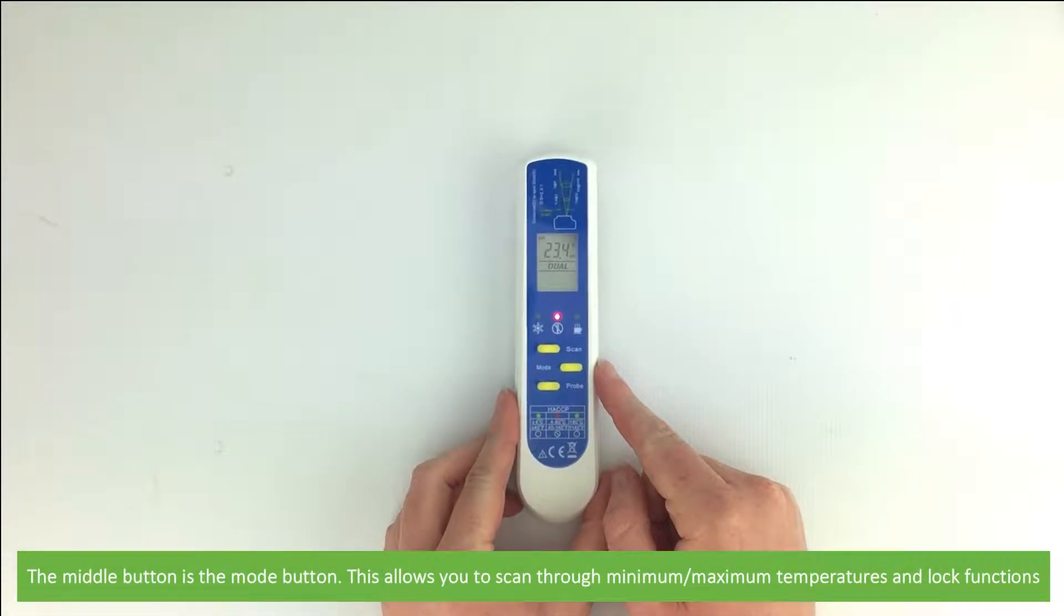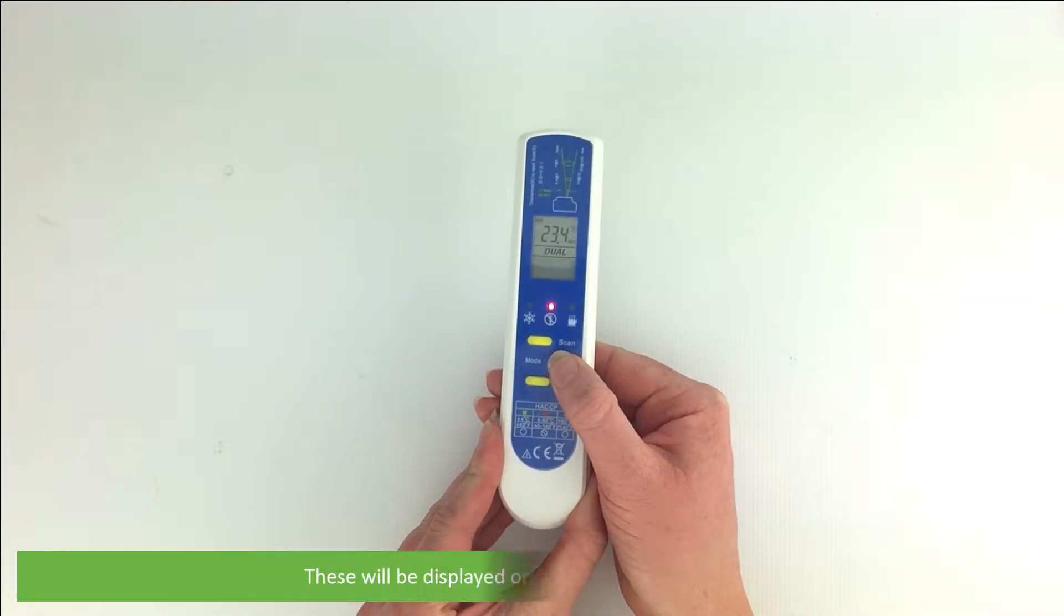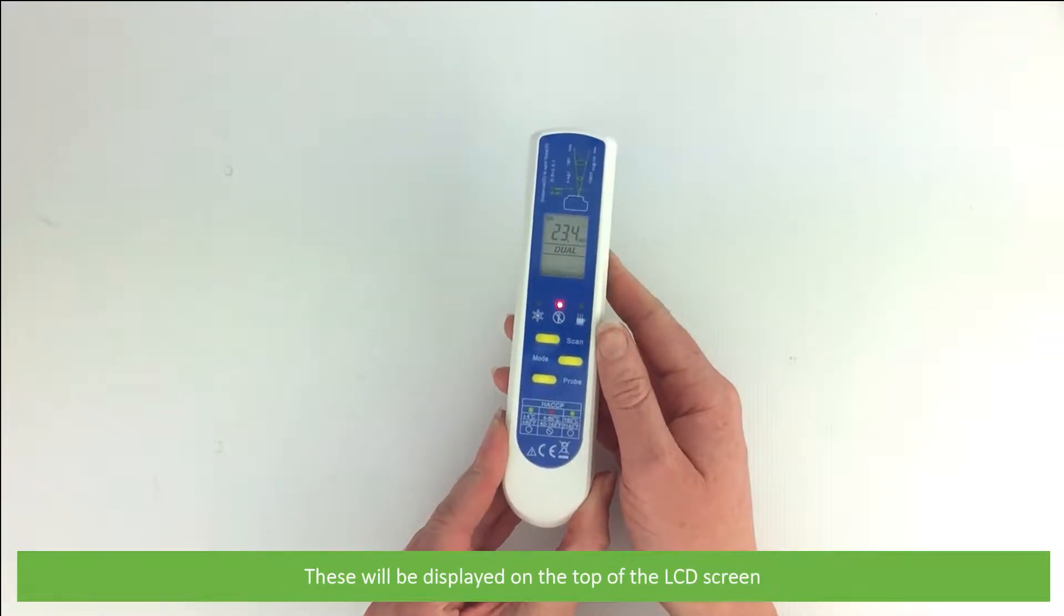The middle button is the mode button. This allows you to scan through minimum and maximum temperatures and lock functions. These will be displayed on the top of the LCD screen.